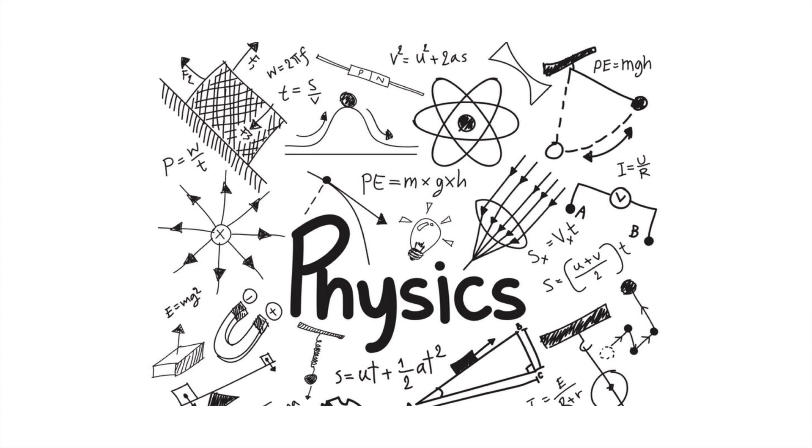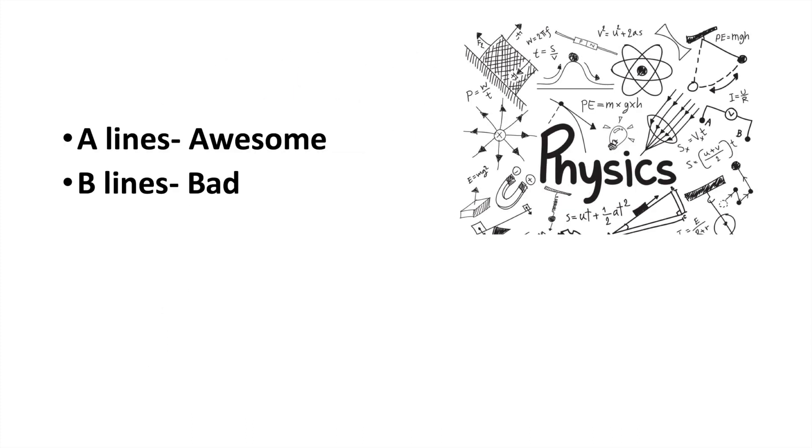Not a lot of physics. We have two patterns of lines you need to recognize. The first one is the A line. If it helps you to remember, A stands for awesome — these lines are the good ones, the ones you want to see. B lines are not as good, as they indicate wet lung. So B stands for bad.